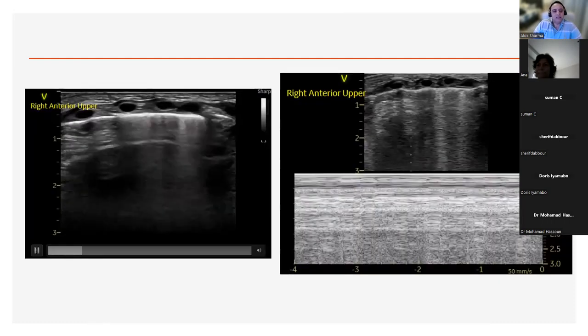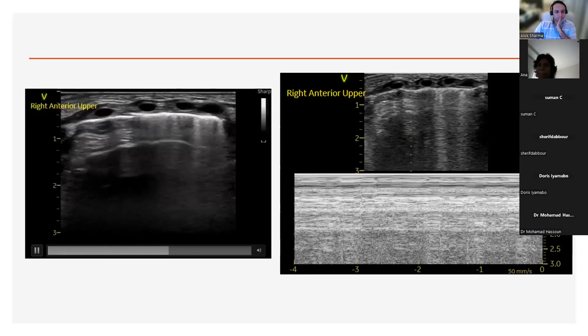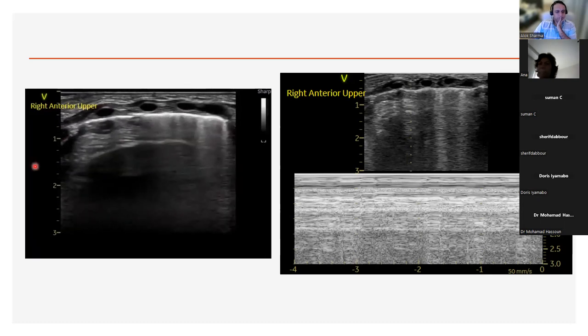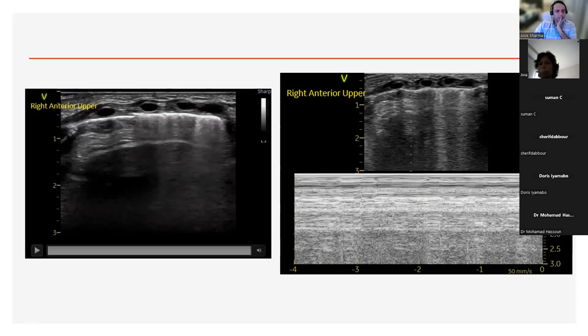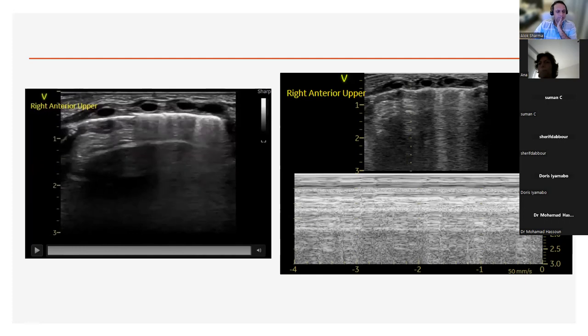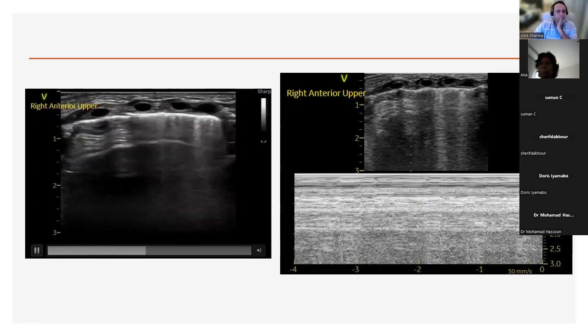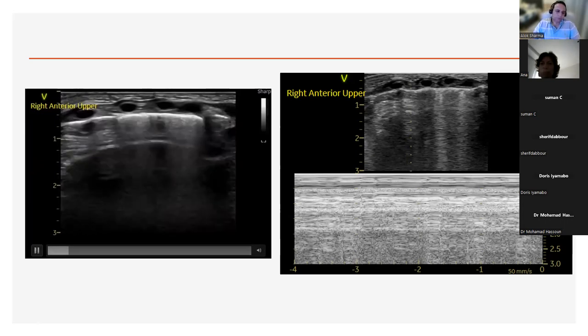So clearly, let's say we're in this situation. So again, would you like to describe this, Anna? The left scan? Yeah. Okay. There is lung sliding on the right of the scan. Yeah. Now it's frozen. With some B lines or comet tails at least. I think we can see depth to the deeper parts. Okay. On the left, I see an A-line.